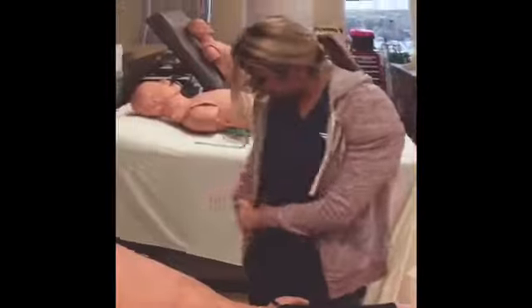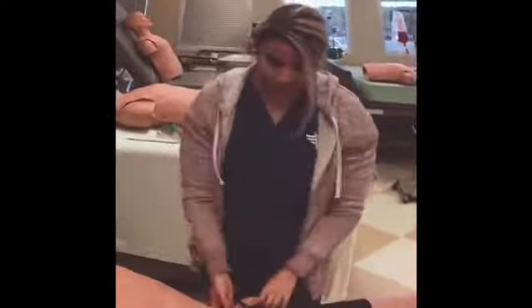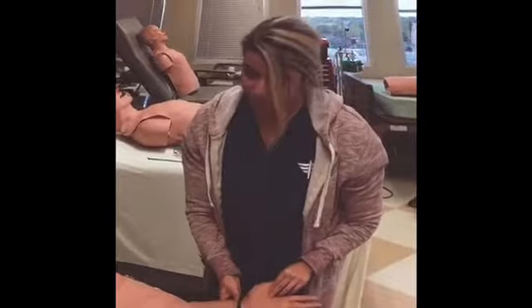So for every device that we will be demonstrating today, you will need to check the chart and physician's order, gather necessary equipment, follow standard precautions and wash your hands, introduce yourself, state your name and department, verify the patient, explain the procedure, confirm the operation of the device, and apply the device to the patient. You will then monitor their vital signs.